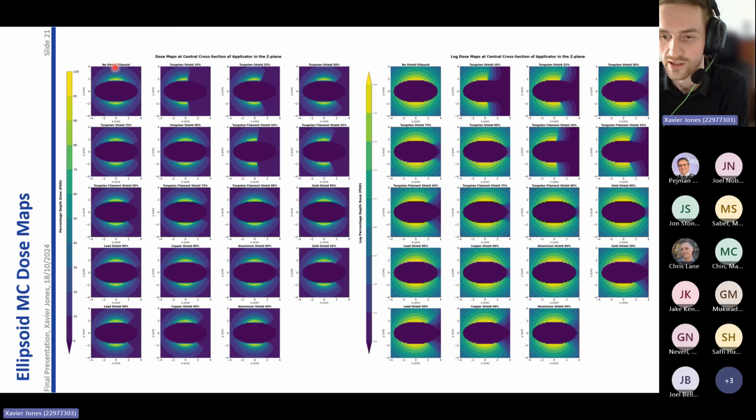The shape may also be used to displace tissue away from high dose regions. In terms of shielding variables, similar patterns described earlier are present here, but overall, each of the distributions presented in all of these dose maps provide characterization for each applicator.